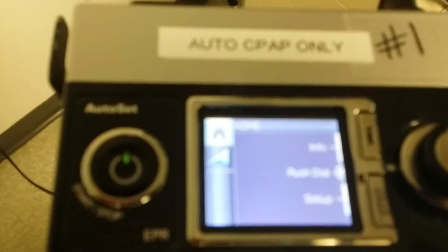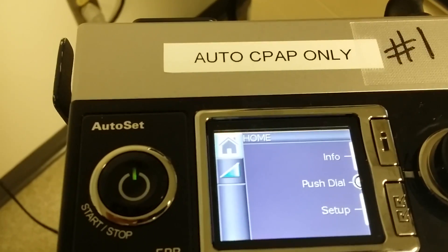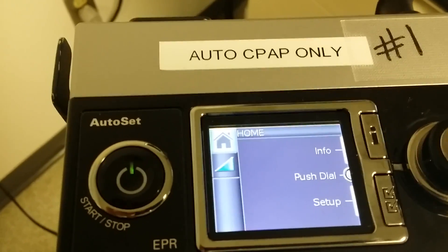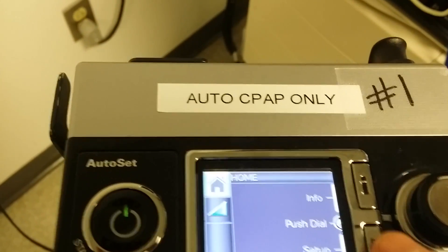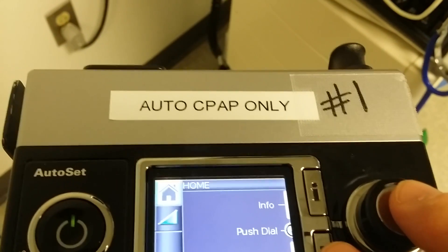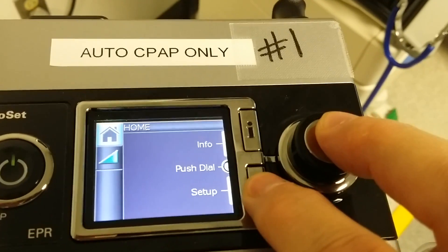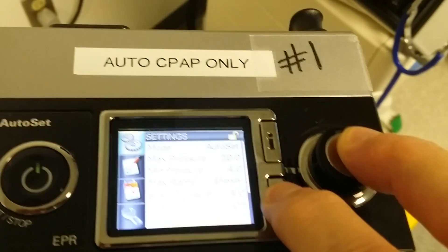As a clinician, the first thing you want to do before you put it on a patient is clear out the information from the old patient. To go into the clinician mode, hit the menu button and the click dial button at the same time while you have power. Hold them both down for about five seconds and you're going to see the LCD screen change.